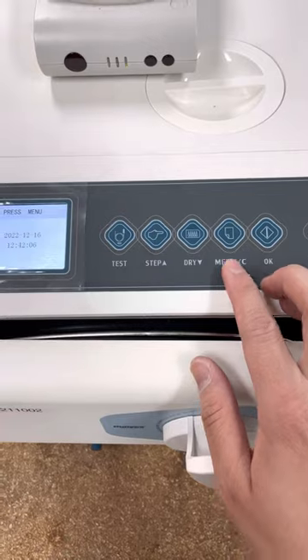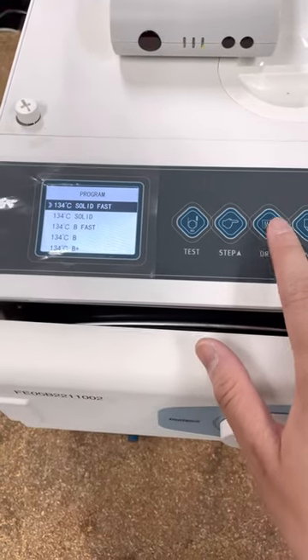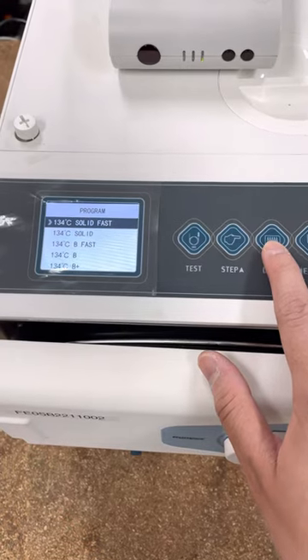In order to select a cycle, you click on Menu and use the Up and Down buttons to go through which cycle you want to use.